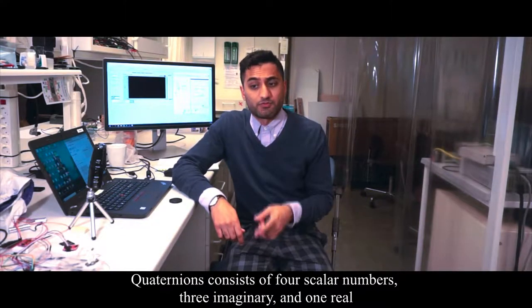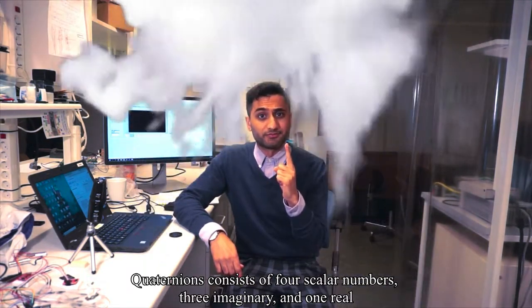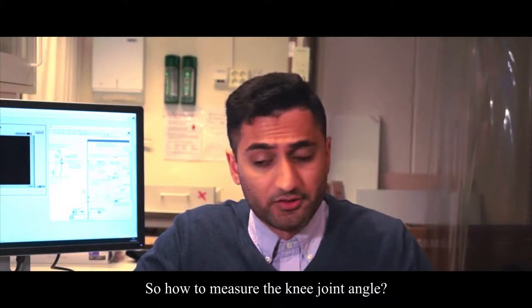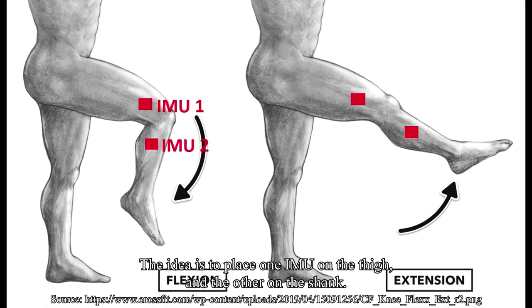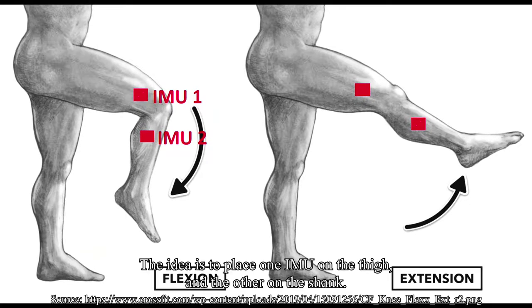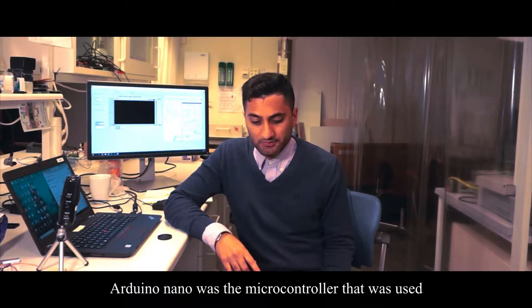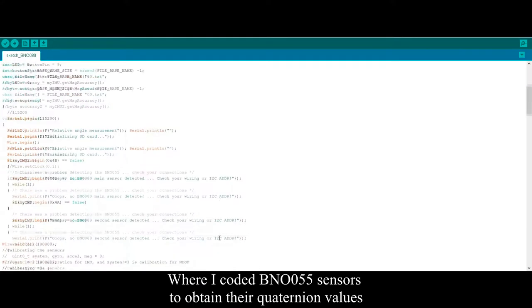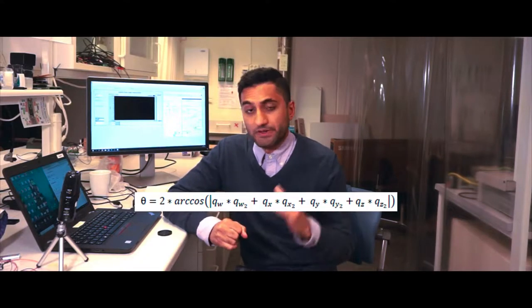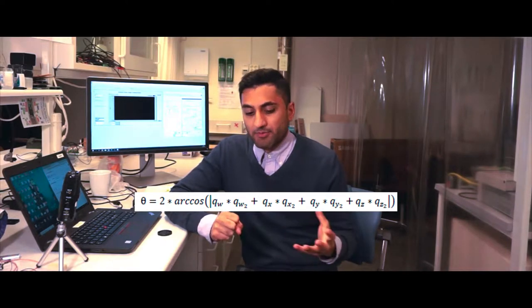A quaternion consists of four scalar numbers: three imaginary and one real. So, how to measure the knee joint angle? The idea is to place two IMUs — one on the thigh and the other on the shank. The microcontroller used was an Arduino Nano, where I programmed the quaternion data from one sensor and multiplied it with the absolute value of the quaternion values from the other sensor, and through that I was able to obtain the angle.